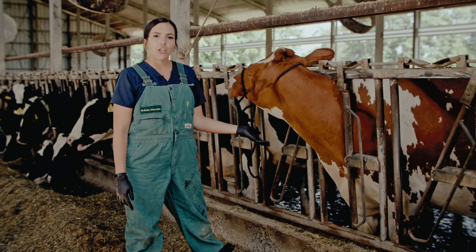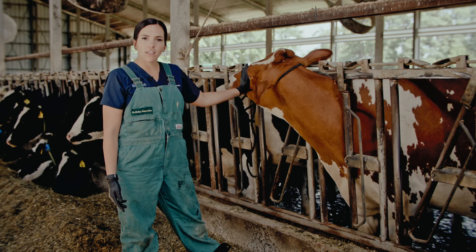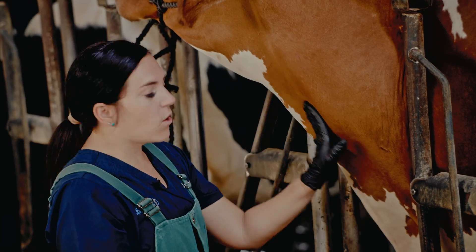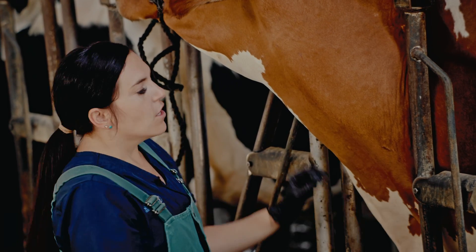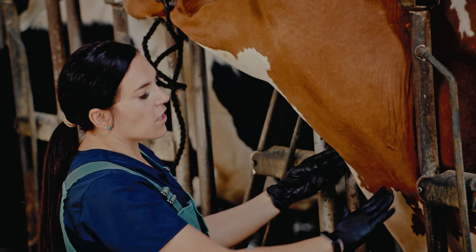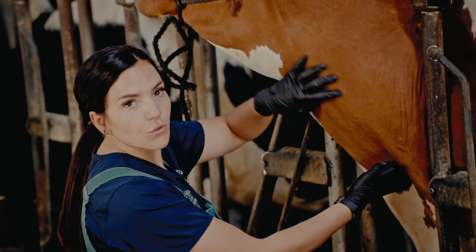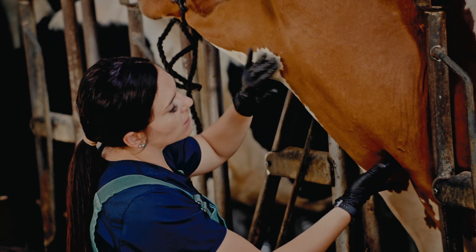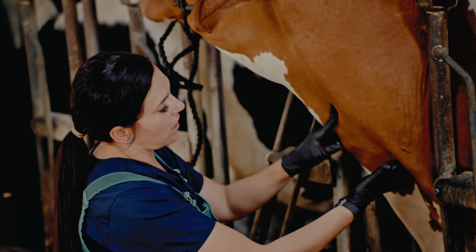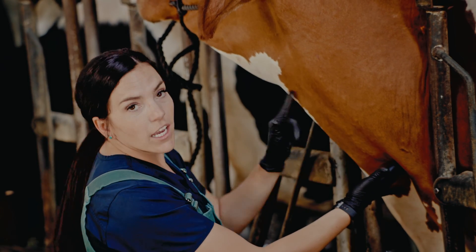Next you're going to identify where the jugular vein is in a cow. You'll have their head securely tied off to the side for safety. The jugular vein lives in what we call the jugular groove — right between the big muscle on their neck and their throat. To isolate the jugular vein for IVing, you want to hold off down by their shoulder in this groove and you'll see it starts to fill. It's filling right here.